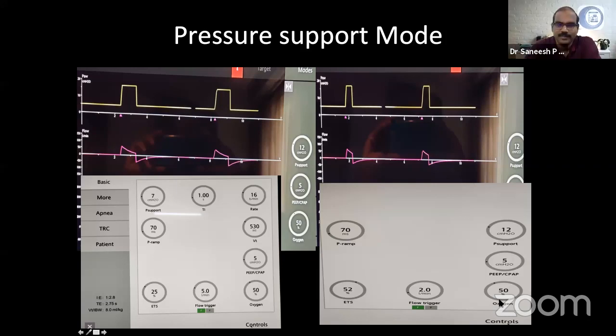The good thing with our modern ventilators is they give all the scalars and loops, so that if your mind knows, your eyes will pick it up. So lots of graphical data and numerical data will be there on your screen. The moment you start picking clues from those screens, you can do justice to the patient and take corrective action at a faster rate.